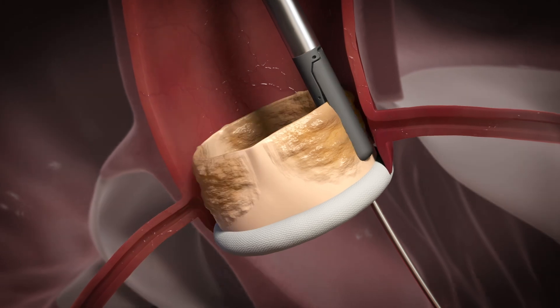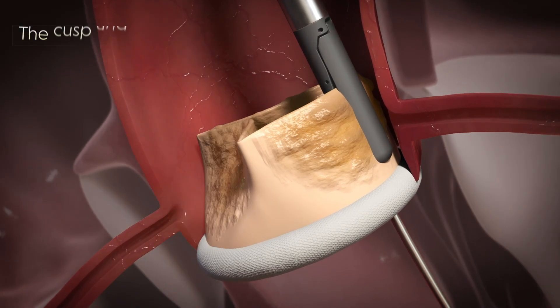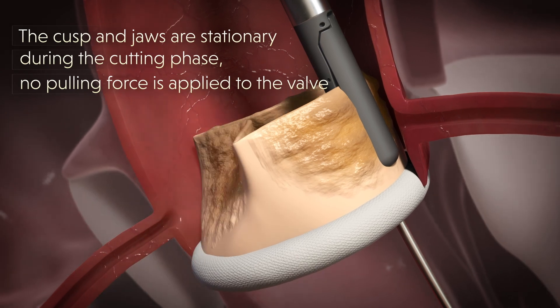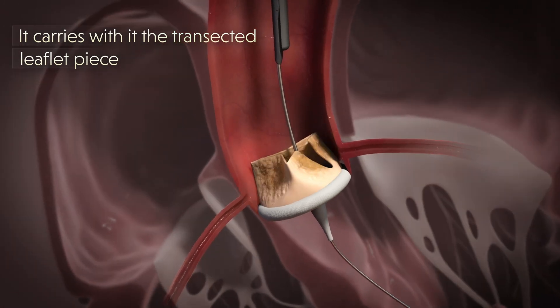When the jaws close, an electrical current is activated by the doctor, creating a U-shaped cutout to be clipped from the leaflet. The cusp and jaws are stationary during the cutting phase — no pulling force is applied to the valve. As the system is withdrawn, it carries with it the transected leaflet piece.